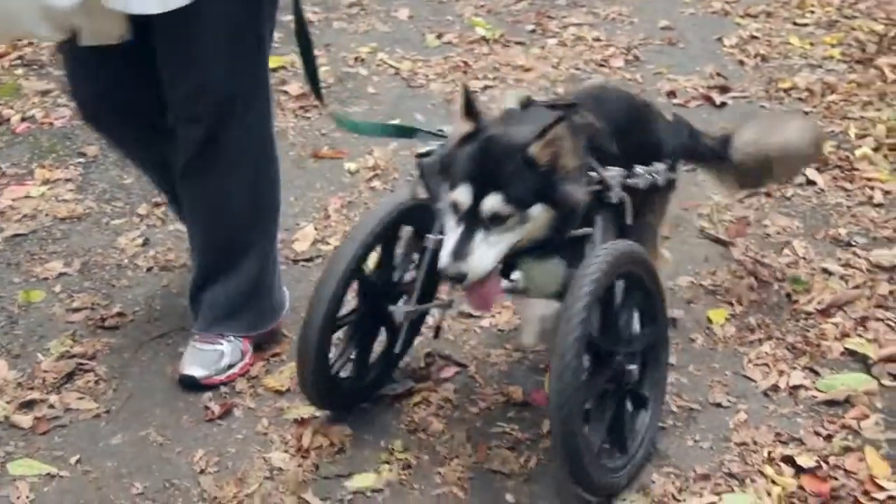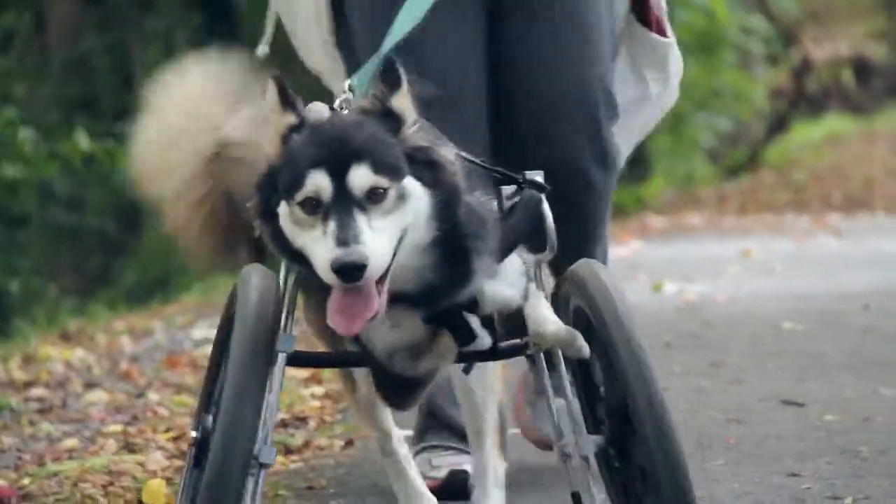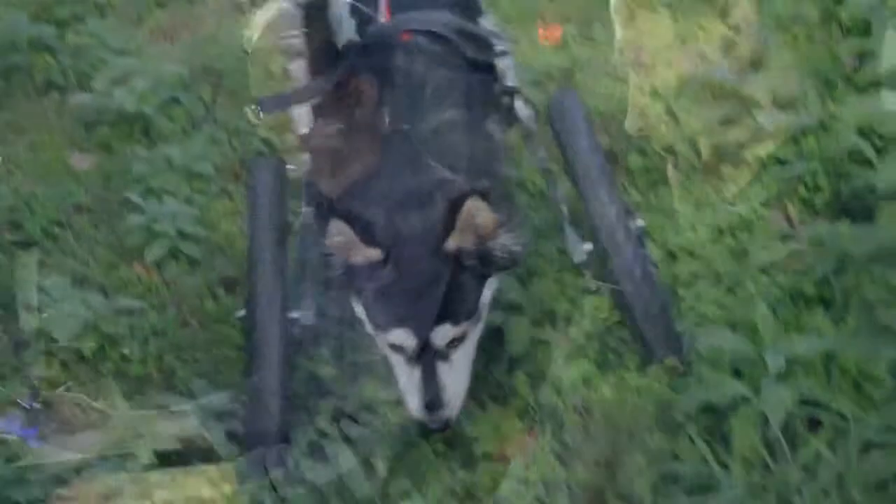We decided to get him a cart, which worked quite well, but they limit his mobility in terms of being able to play with other dogs, and it's not really the full motion of running.